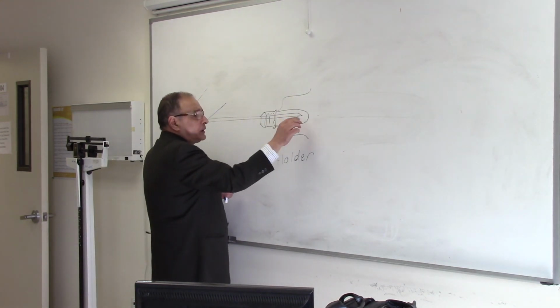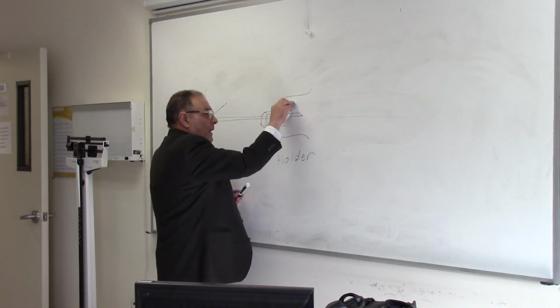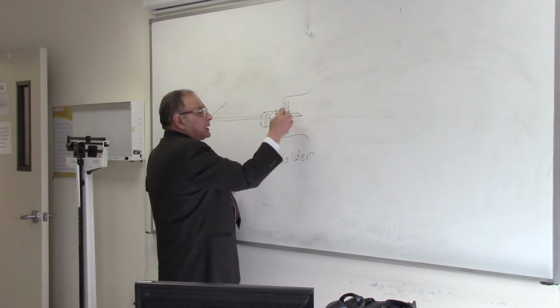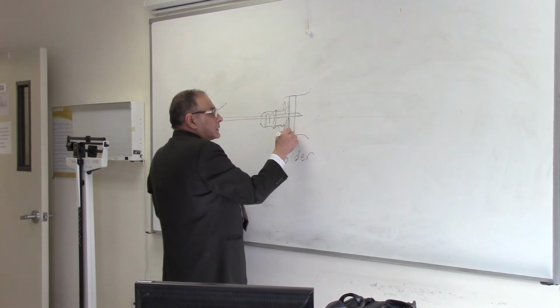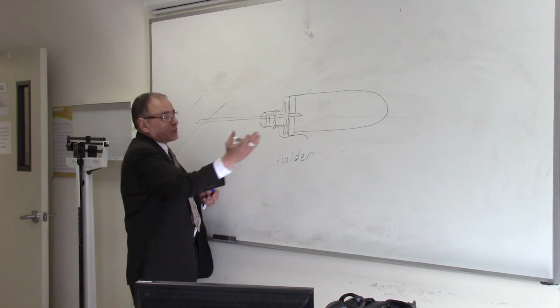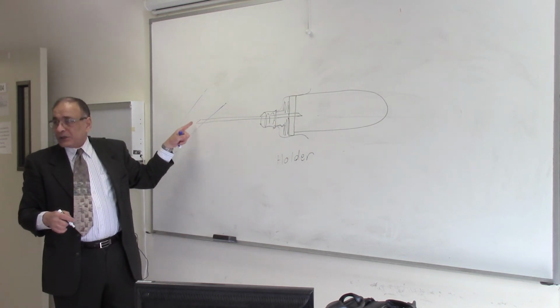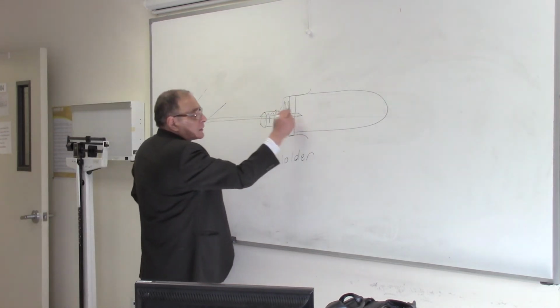When you press the tube, this rubber sleeve will shrink, taking this position, and the tube will be here. Because you're pushing the rubber sleeve inside, right? Now the inside of the tube is connected to what? To the vein. And the pressure here is higher. So the blood will be drawn from here to here.